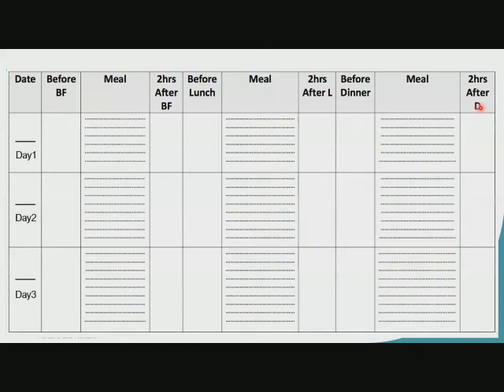In addition to that, if you feel any abnormality, any signs of hyper or hypoglycemia or anything abnormal, you need to check. So it's a minimum of 6 plus any other occasions. For some people they would say this is too much checking. Yes, but the golden rule is the more you test, the more you get to know about the level of glucose and about your body and how your body interacts with the different foods and activities.